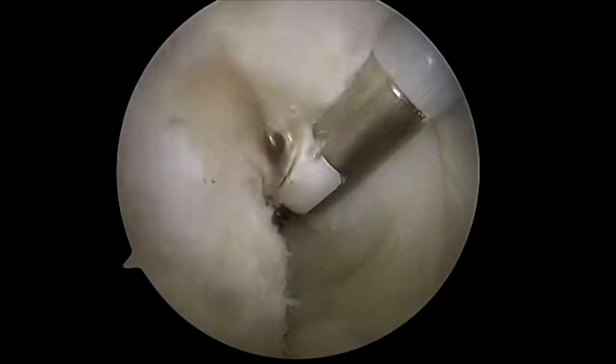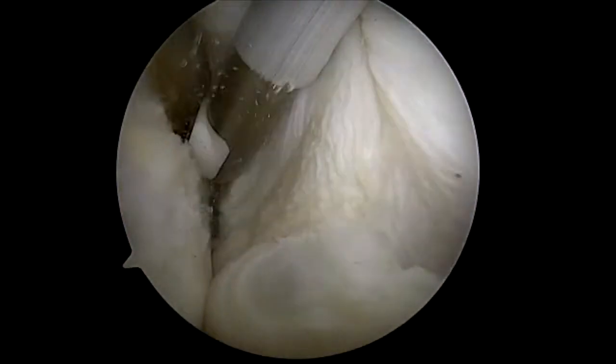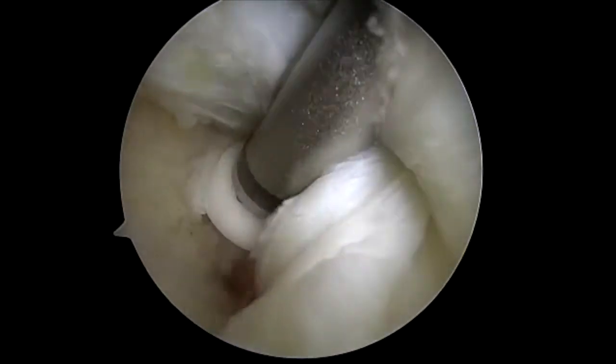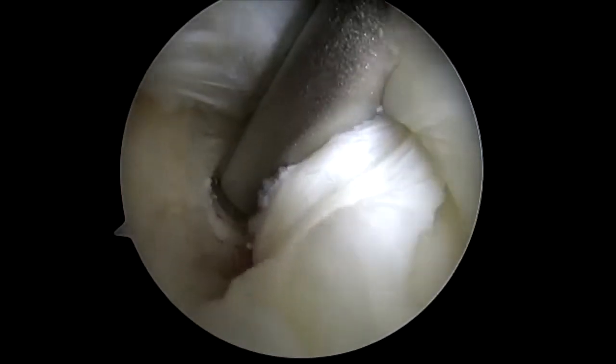I'm using a wand to broaden the tear and prepare the bony footprint. I then punch a pilot hole for a 4.75 swivel lock and implant the swivel lock.